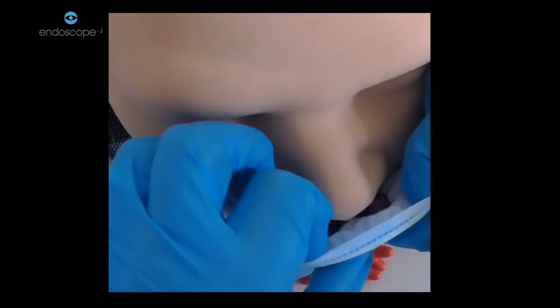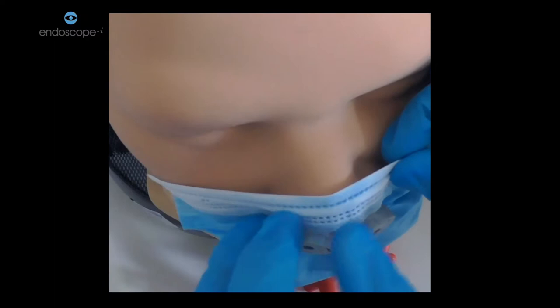When adjusting the mask, you can use the metal strip on most surgical masks to fit it around the bridge of the nose. Make sure that the inner aspects of the valve are aligned with the nostrils, and then you're ready for the next step.